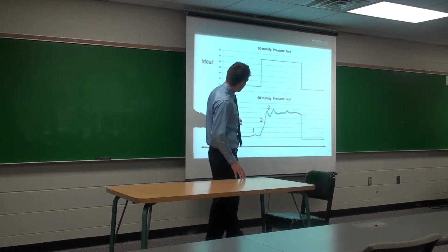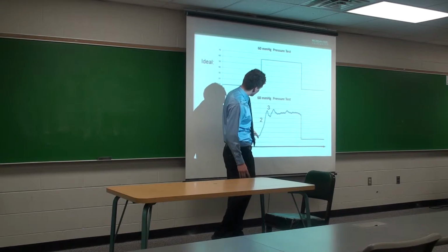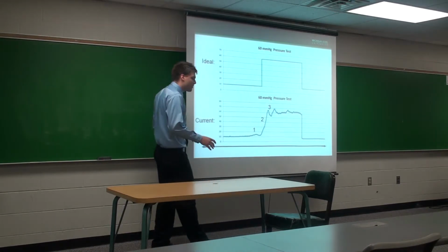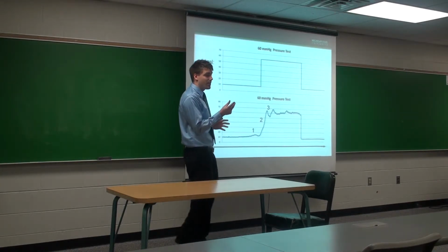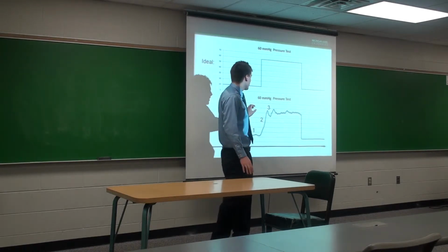Secondly, and probably most importantly, is this. You can see this rises instantaneously. Now, this has a slow rise time to it of the order of 3 to 4 seconds. And this is because the lab assistant has to really concentrate not to overinflate the balloon and hurt the animal. So it has to be really, really slow. So we hope to correct that.